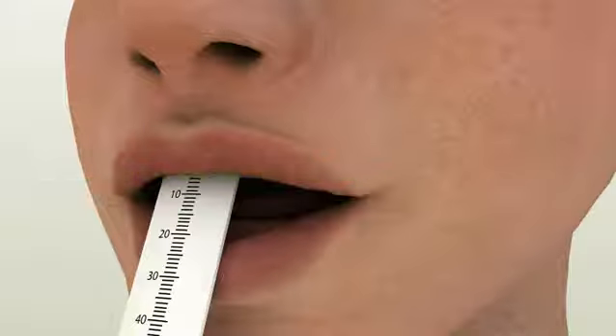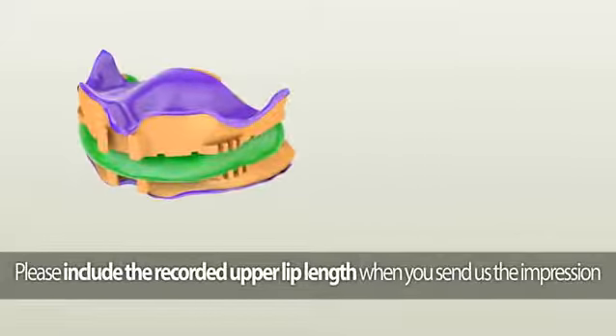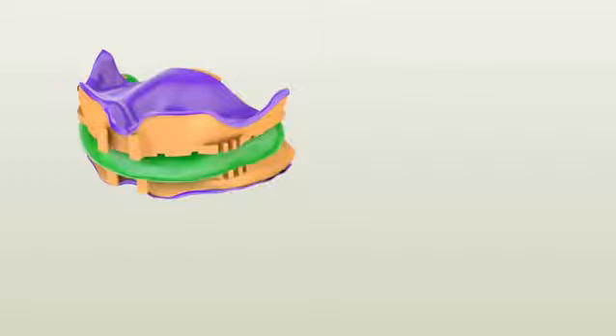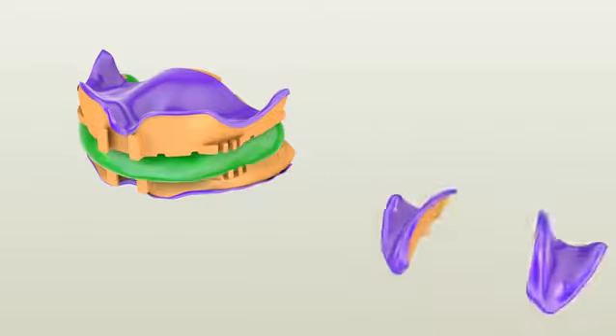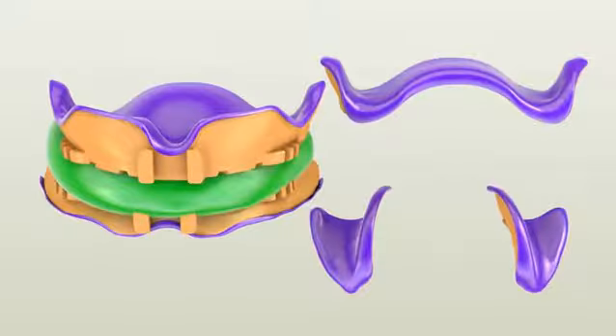The measurement should be from the incisive papilla to the upper lip line, which will be needed for the online order process. After placing your order online, pack everything and ship to Dent Co Incorporated. In the box you are shipping, you should have the anterior parts of both maxillary and mandibular impressions with the bite registration material in between, plus the two detached posterior parts of both maxillary and mandibular impressions.